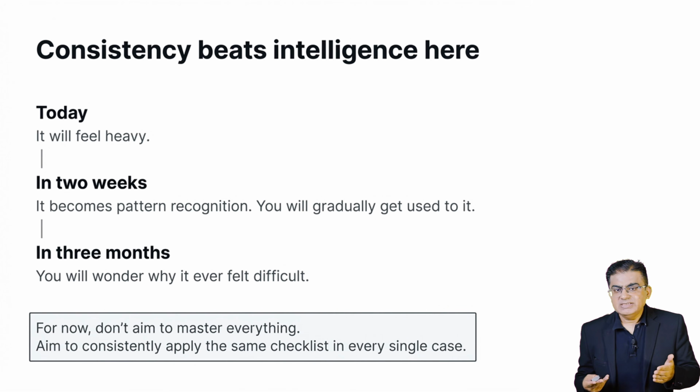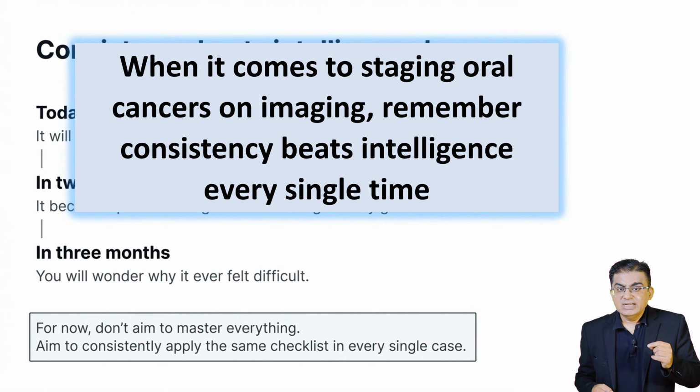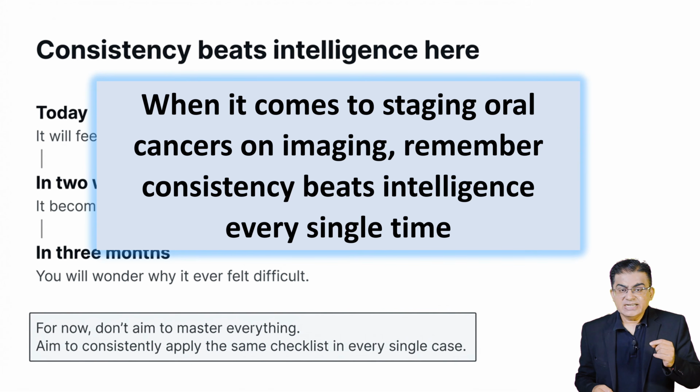So for right now, please don't aim to master every single thing on the scans. Your only goal should be to consistently apply the exact same checklist to every single case that comes in your OPD. When it comes to staging oral cancer on imaging, remember, consistency beats intelligence every single time.